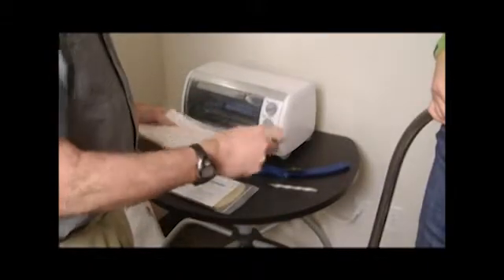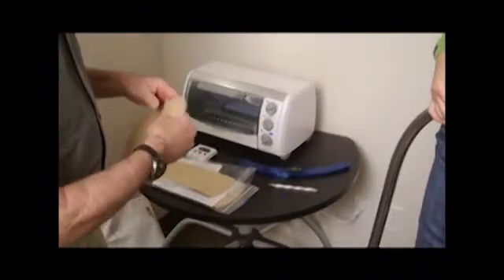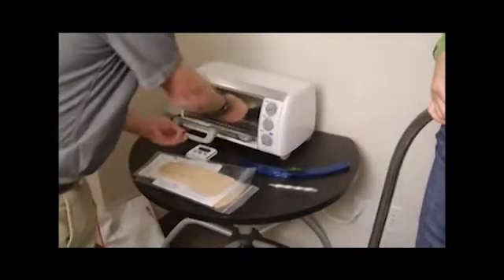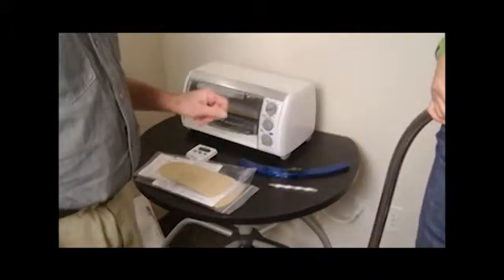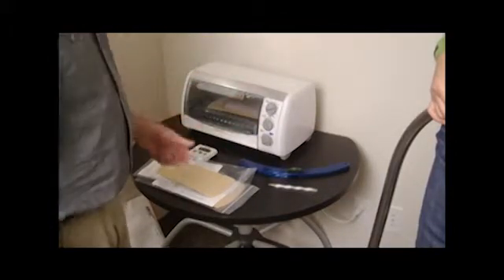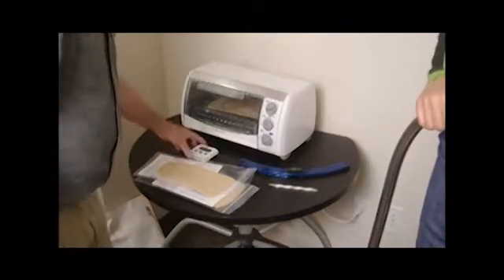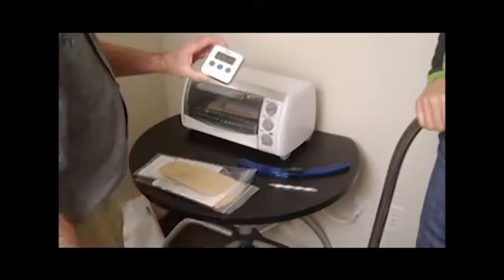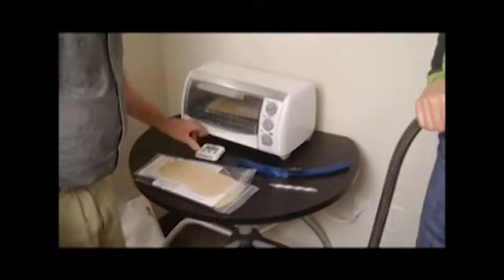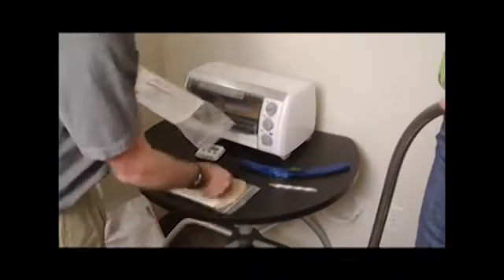The two pieces that are marked, we're going to place in the oven at 300 degrees. Make sure the oven is preheated so it's not heating up during this initial stage. This oven is already set for 300. We've got our countdown timer set for 1 minute. And while that's heating, I can fill out the paperwork that's enclosed.